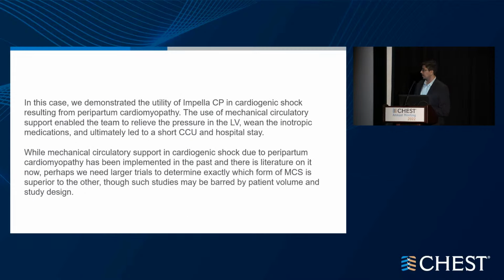So again, we demonstrated the successful use of Impella CP in cardiogenic shock resulting from peripartum cardiomyopathy. The role of mechanical circulatory support enabled the team to rapidly wean down her pressors. We were able to offload the pressure in the left ventricle, which ultimately led to a shorter stay in the CCU and in the hospital altogether as well.